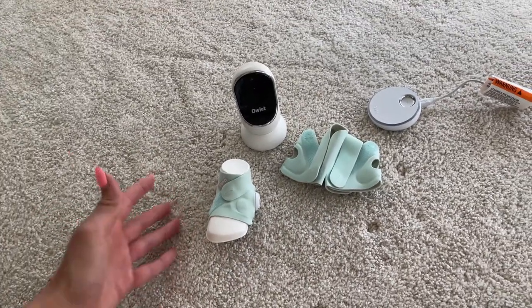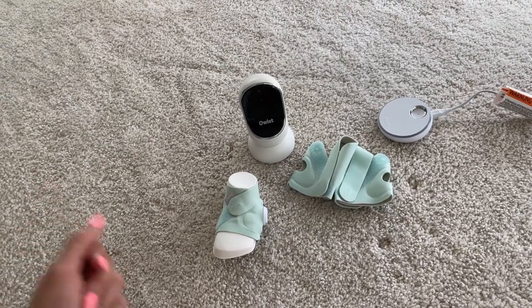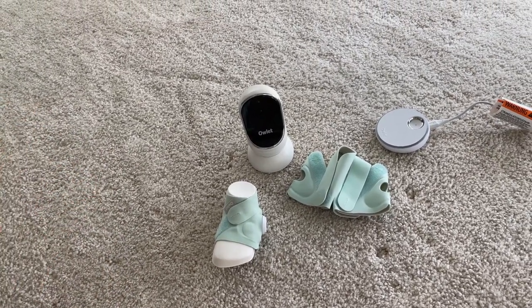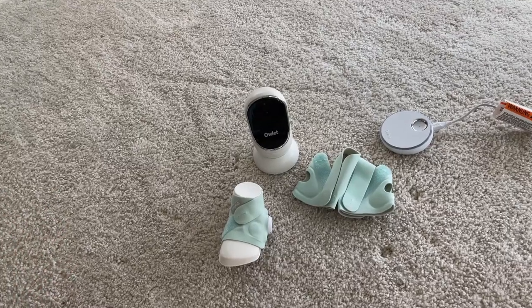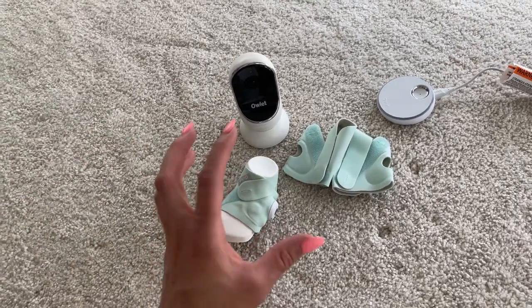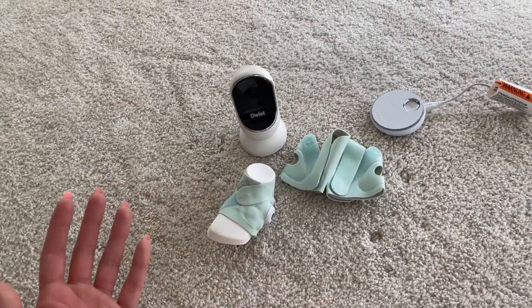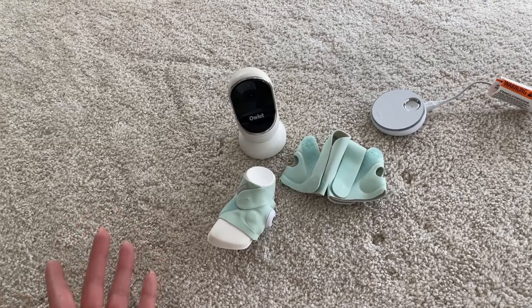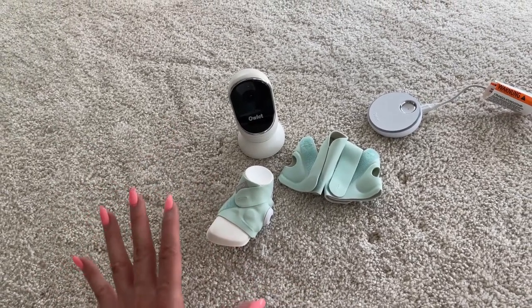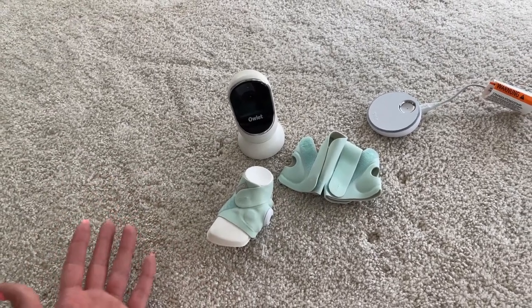You should definitely look into it, see all the features that it has, and see if this is a good fit for you. But for me it really helped with my anxiety — I just slept through the night a lot better knowing that my baby was safe. At least I would get some type of alert if anything was happening to her, and that made me feel a lot better and I got more rest through the night.